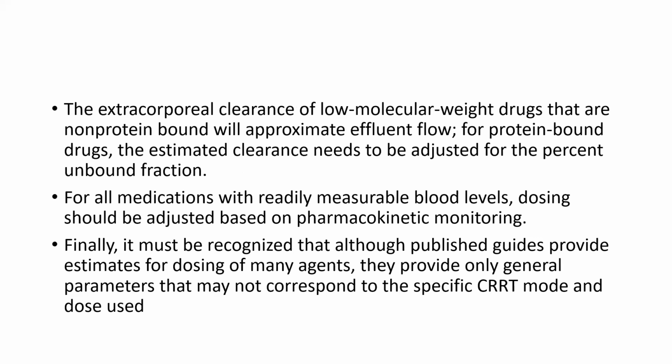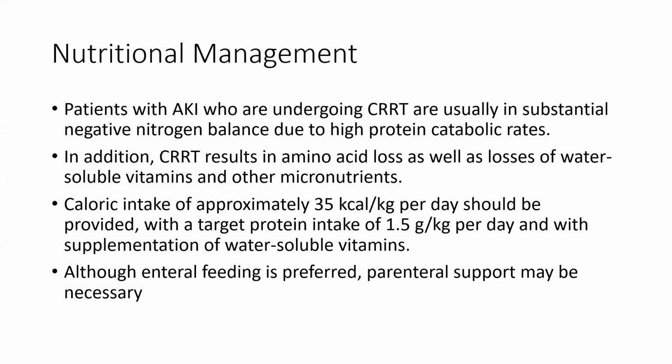So the extracorporeal clearance of low molecular weight drugs that are non-protein bound will approximate the effluent flow, and for protein bound drugs, the estimated clearance needs to be adjusted for percent unbound fraction. For all medications with a readily measurable blood level, dosing should be adjusted based on pharmacokinetic monitoring. Finally, it must be recognized that although published guides provide estimates for dosing of many agents, they provide only general parameters that may not correspond to the specific CRRT modality and dose used.